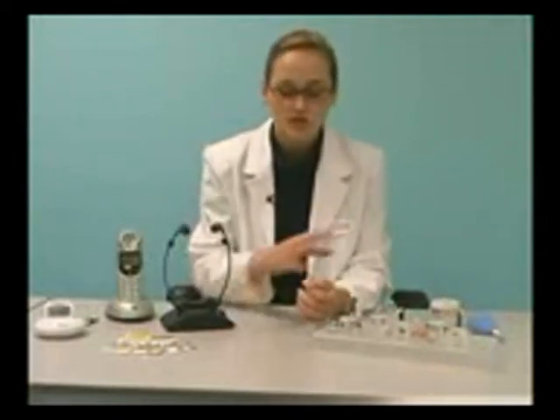But the amplifier was much simpler and could only be manipulated by transistors. So any control that you had over the sound of the hearing aid had to physically be built into the hearing aid itself. So we were really limited by the space. And so the functionality or our ability to adjust the hearing aid was quite limited.